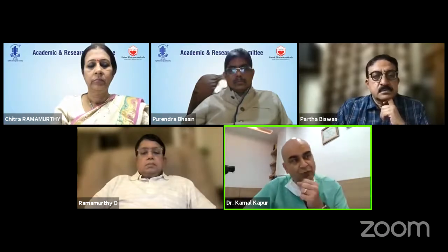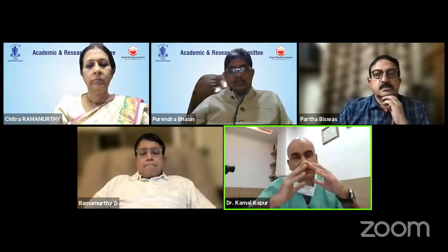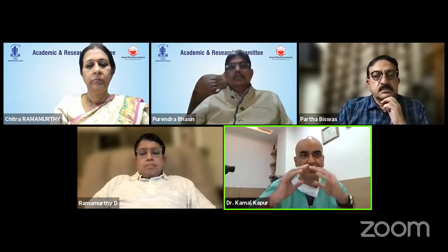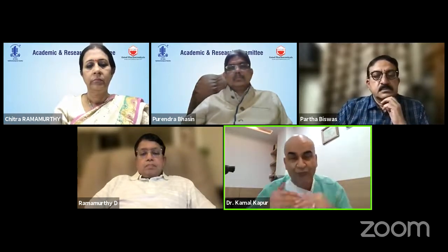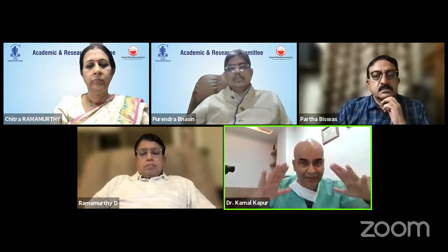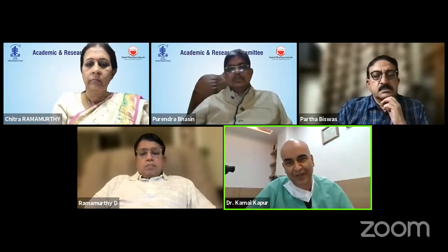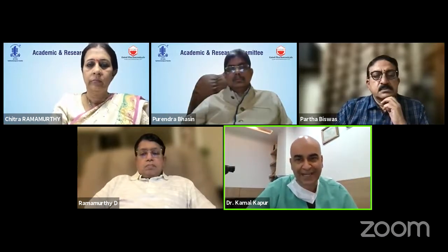That's one. Number 2, if you're looking at a keratoconus patient, 2.8 is again not your bandwidth, because in keratoconus patients, a lot of times, if it is a central steepening of the cornea with the forme fruste, you may get a false anterior chamber depth. I remember in the last session we had on this, I presented 2 cases like that.